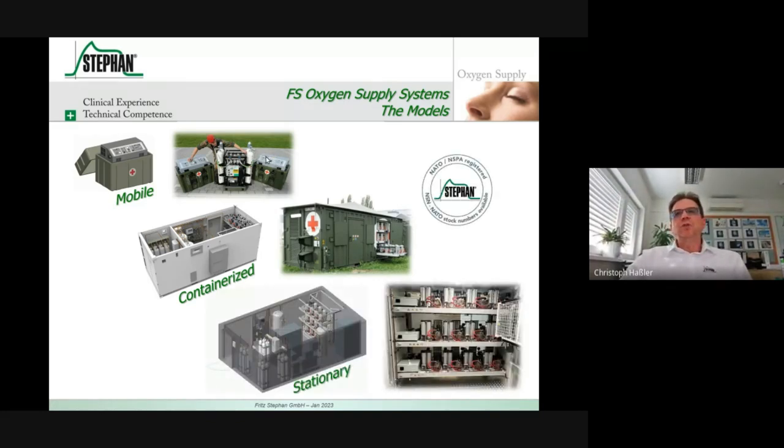We normally do not allow refilling of that, because it's very tricky to fill them. You need to have a clean environment. There are also some pistons and seals inside. So changing and refilling them by customers is a problem. You can send it back to us and we will refill it, or you can have an exchange module. We do not think customers can successfully refill those things, because we experienced a lot of tricky things to make them reliable. But over 10 years is a value.